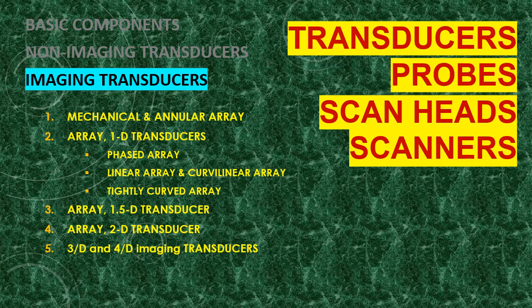array 1D transducers like the phased array, linear array, curvilinear, and tightly curved array, and the array 1.5 or 1.5D transducers, also array 2D transducers, and lastly we'll discuss the 3D and 4D imaging transducers or techniques.